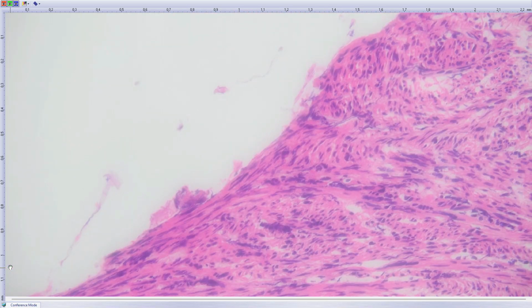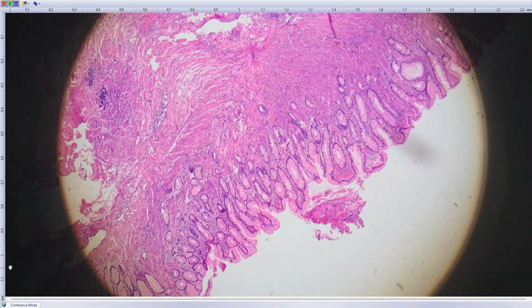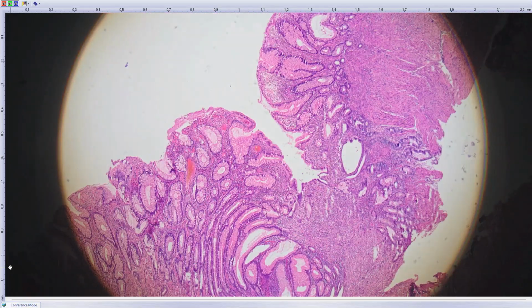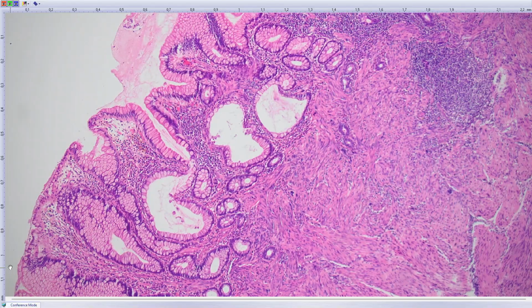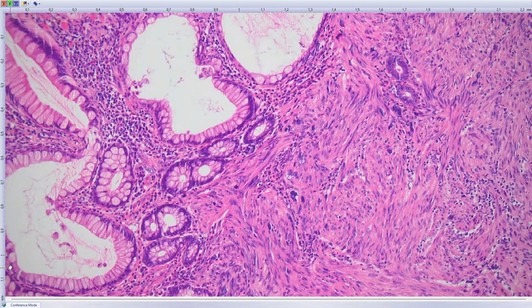The biopsy is a little bit crushed, but we fortunately had another piece of tissue, which is quite more obvious that it's a tumorous proliferation. So just by H&E, a smooth muscle proliferation, it was of course confirmed by immunohistochemistry.